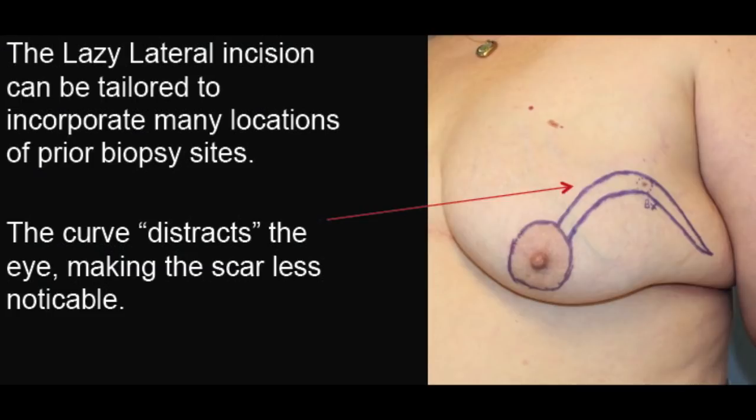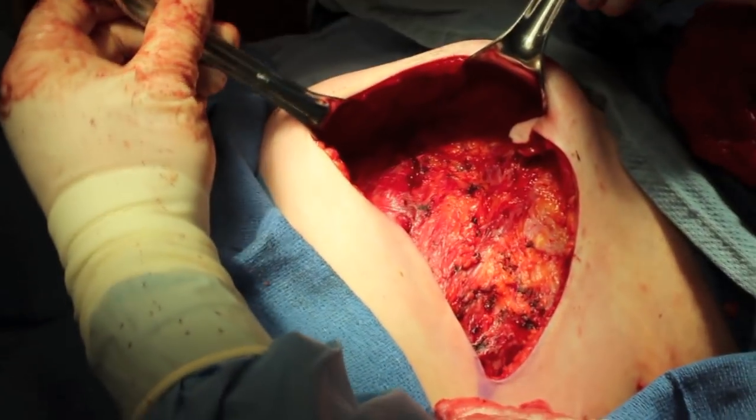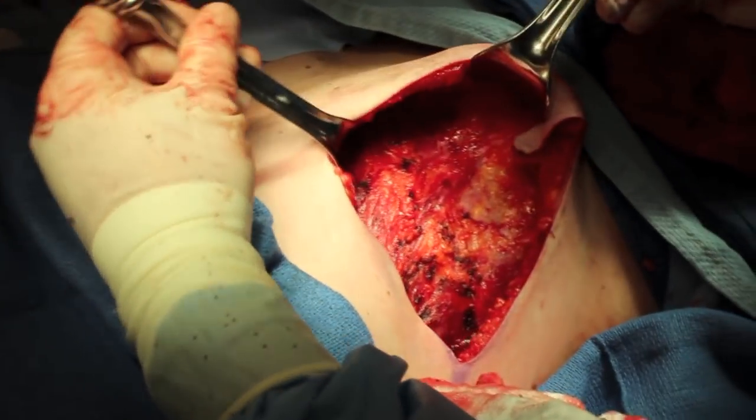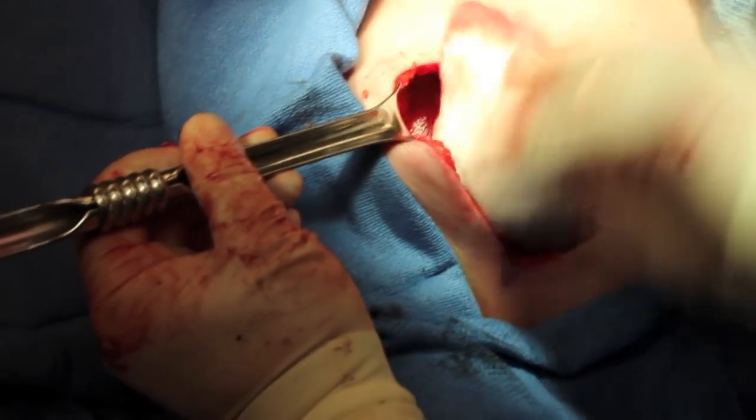Here is the type of incision that we utilize. It's a lateral curvilinear incision, which hides the scar well. And when compared to the traditional mastectomy incision, in the black line, it is much more aesthetically pleasing and natural. Here we were after the last video, with the breast being removed and all of the loose skin left behind.